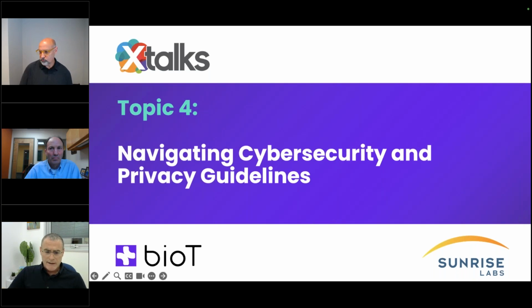Basically, the main thing you need to cover is showing that you are doing vulnerability assessment and vulnerability management. It's being done through threat modeling, conducting active things like penetration testing and code scans.